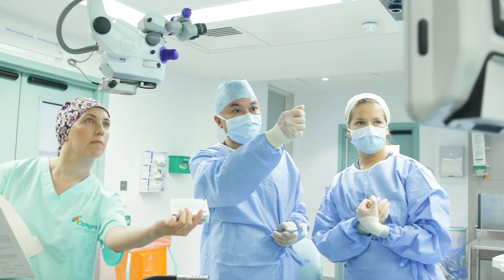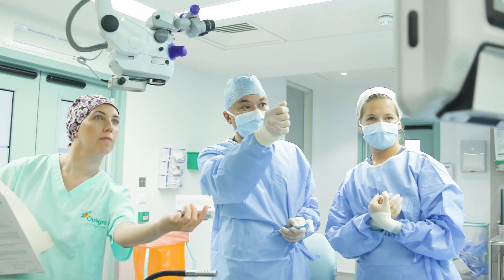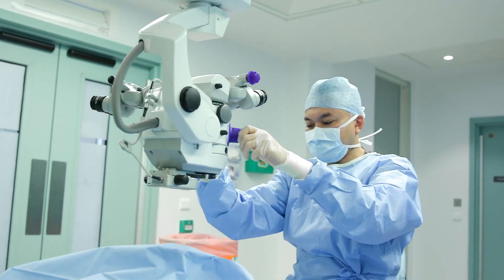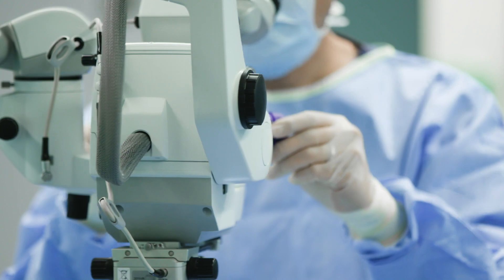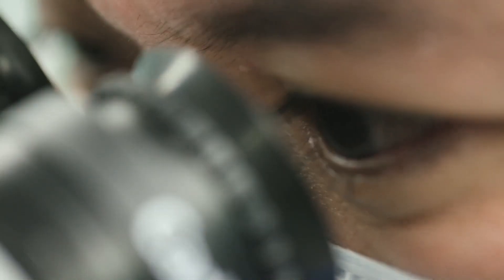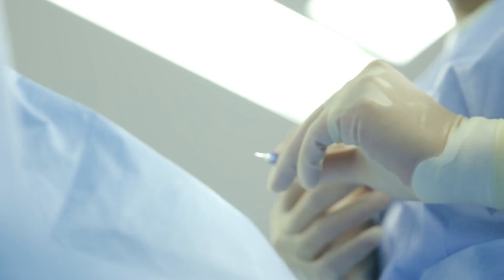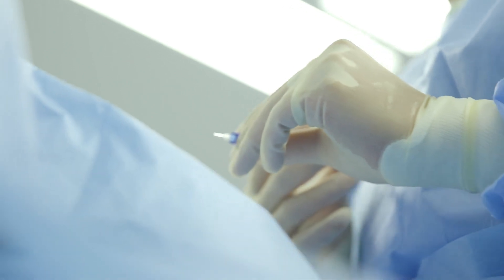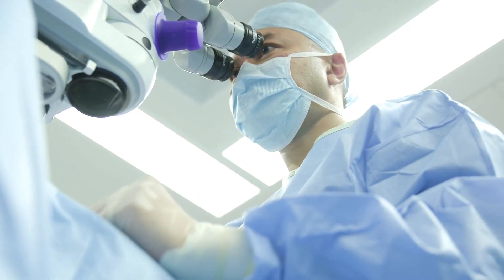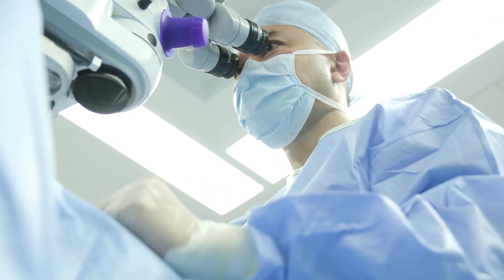EQ Workplace has really increased my productivity significantly. We're able to do 35 to 38 patients — an increase of about 25% — on a surgical day, while not compromising on safety and also not rushing.